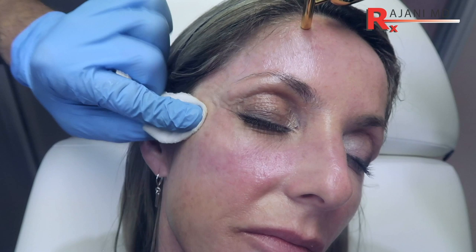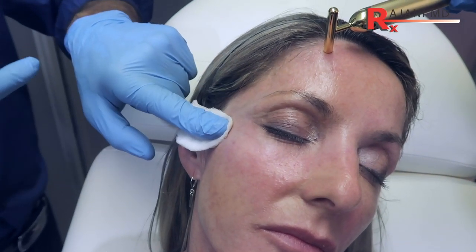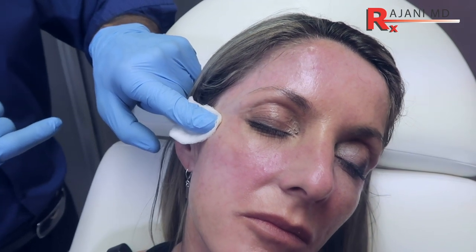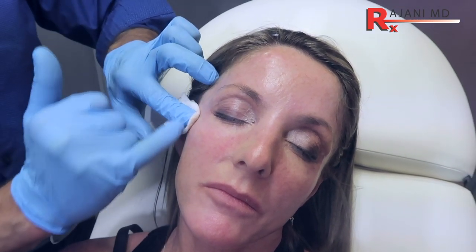You should never see more than that in terms of blood — it's really a bloodless procedure because of the injection plane above the zygomatic bone, and that's what we teach in the courses. The fact that Sculptra is not going to wear off with movement of the temporalis like a hyaluronic acid would means it doesn't need to be repeated to that extent. That's Sculptra in the temple — filling the temple is part of the frame, it helps lift the eye, and especially in Europe people like to massage that back, fill this area, and get that towel-around-the-head look and feel.